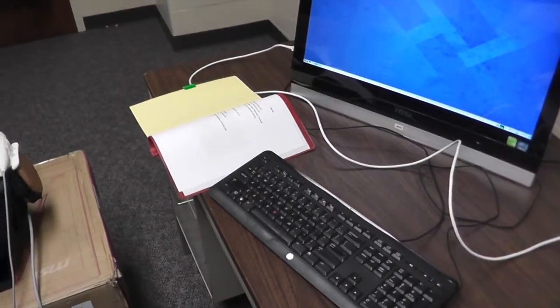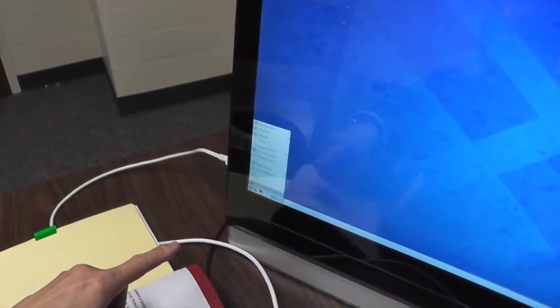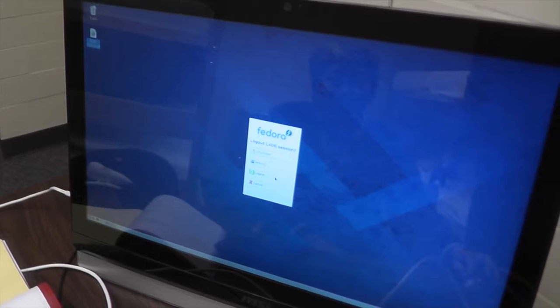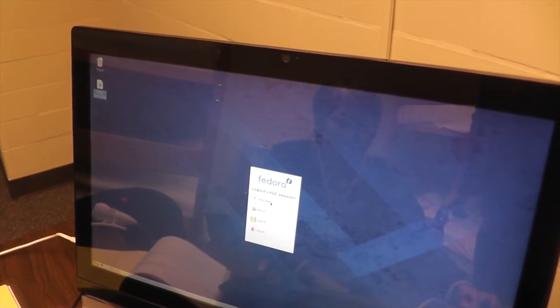At this point, you should power down the electronics box of the tracking system. Then go to the little F on the left corner, log out, and then if someone else is coming, you can just log out. However, if the simulator is done for the day, then you should shut down.